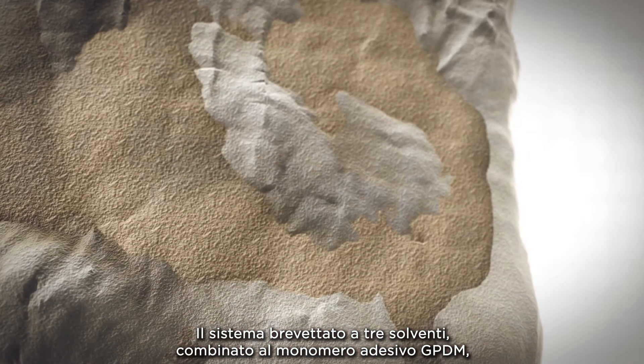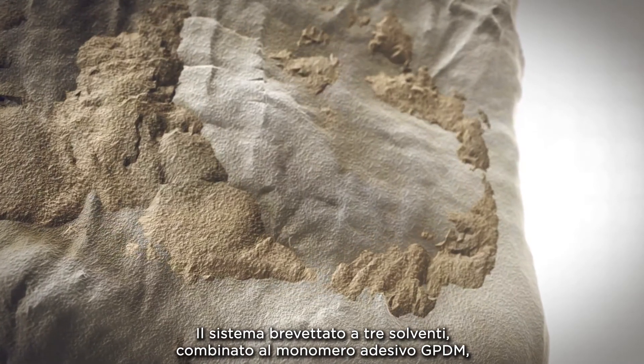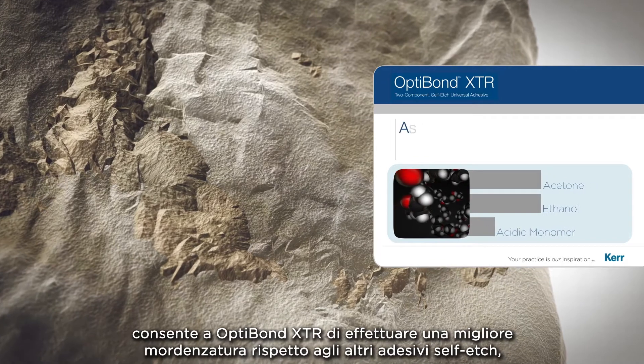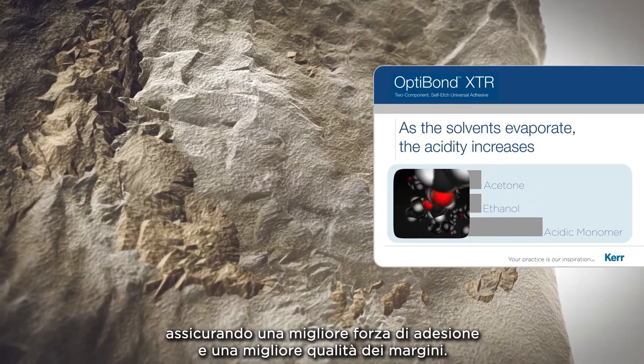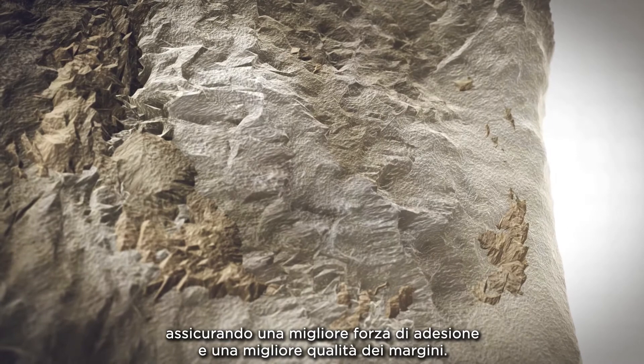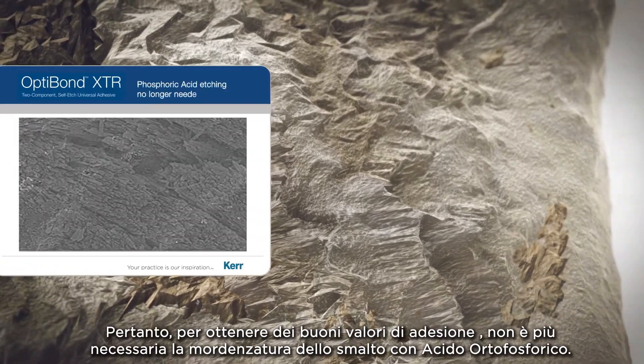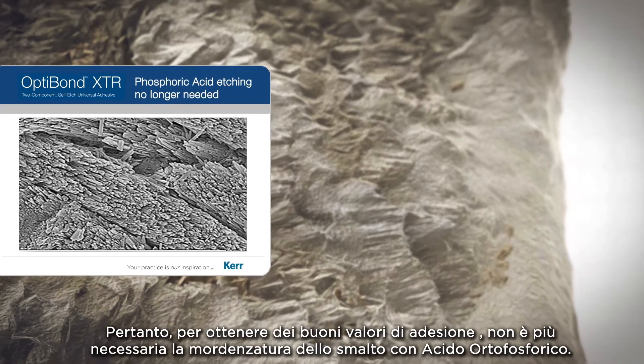The patented 3-solvent system along with the GPDM adhesive monomer in OptiBond XTR is able to achieve a better etch pattern than other self-etch adhesives for better bond strength, durability, and less marginal failure. Therefore, phosphoric acid etching of the enamel is no longer needed to achieve good bond strength.